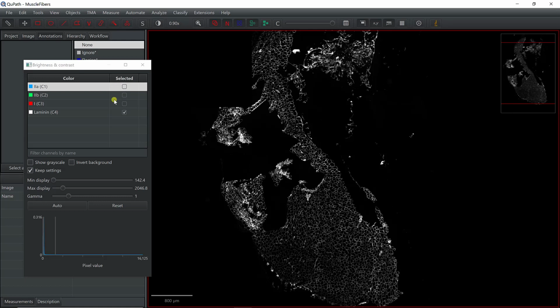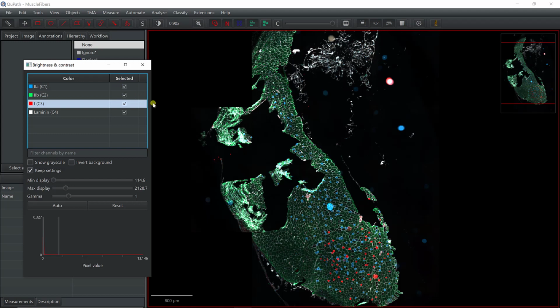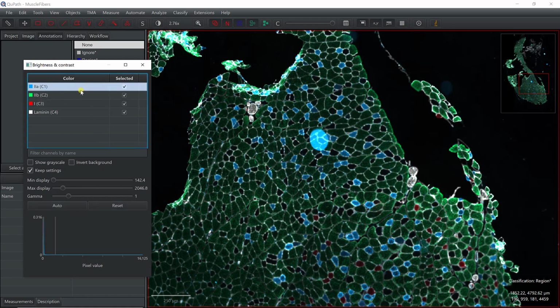So the first thing when you're working with fluorescence images is to actually adjust the visualization parameters. So let's go back to the 2A. Here I can use the reset. I'm not on the right one, so you need to check to actually select the right channel.